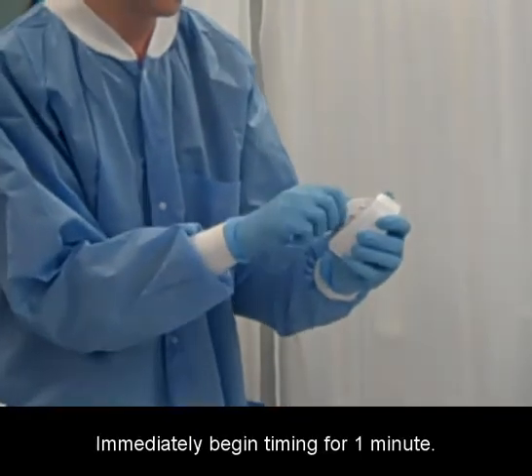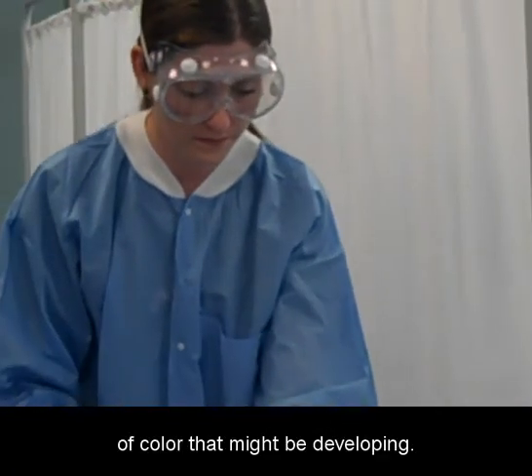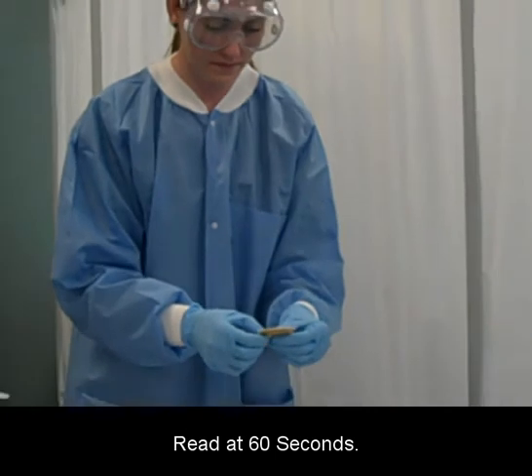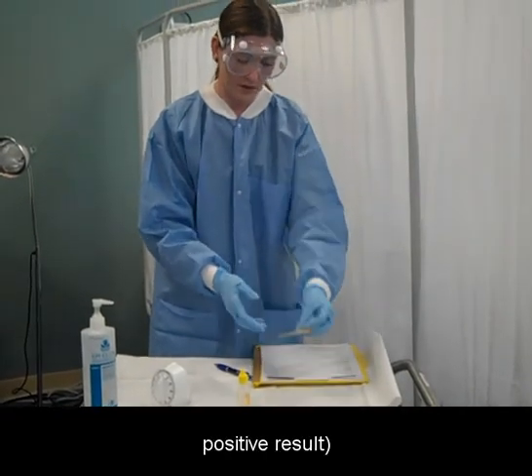Immediately begin timing for one minute. At 30 seconds, watch closely for any change of color that might be developing. Read at 60 seconds. Compare the test with the control color and read the results.